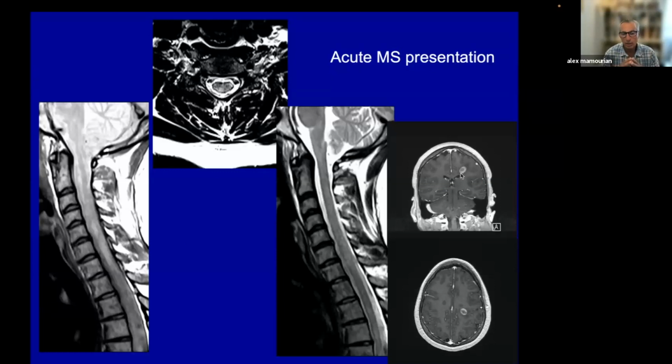So again, you want to think about the underlying pathophysiology in these patients. In the case of a metastatic lesion, you have a patient who has, in theory, a normal volume of the brain where you're adding something to the volume of the brain. That is the growth of the metastatic tumor cells, which are going to be space occupying. In the case of demyelinating disease, you are looking at an injury to the existing white matter. And so oftentimes the degree of mass effect is not proportional to the amount of brain that's involved.